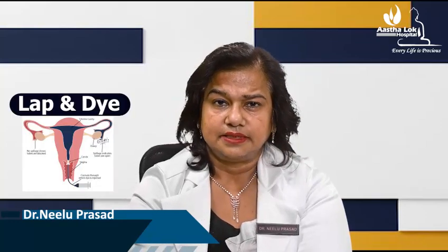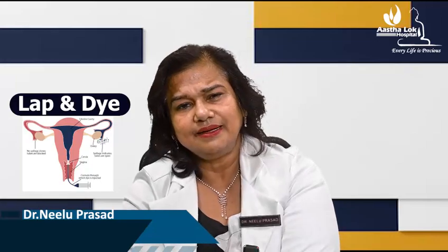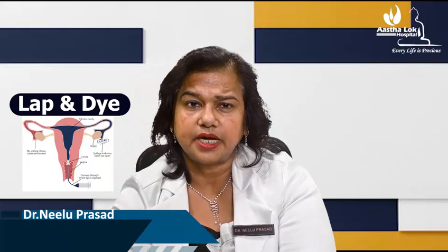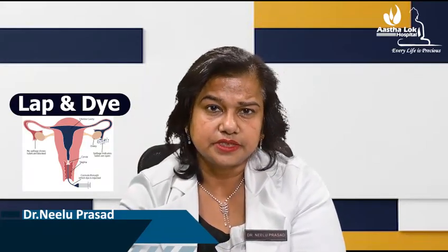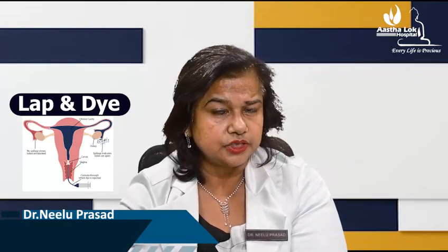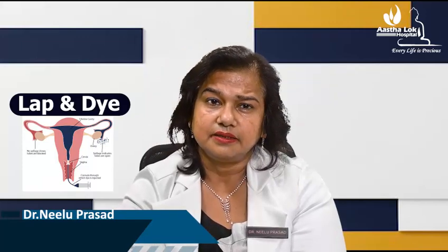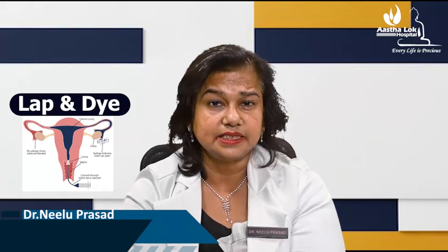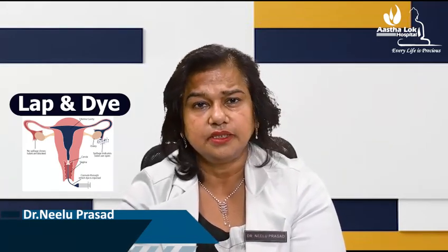This test is a gold standard test to diagnose the patency of the tube. Although the alternative, the HSG test, is also a diagnostic tool to diagnose the patency of the tube. It is done as a routine procedure and dye is passed through the same route and an X-ray is taken, and when the dye is pushed into the cavity the spillage is seen and captured by the X-ray, and the diagnosis is done about the tubal patency.